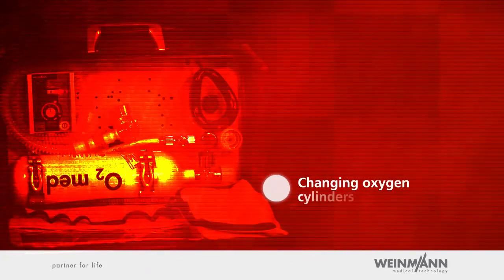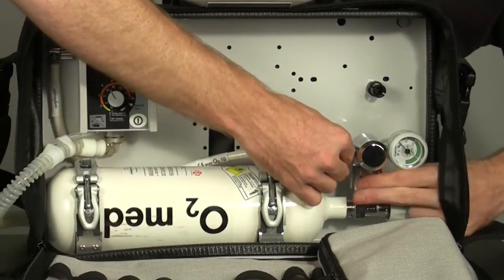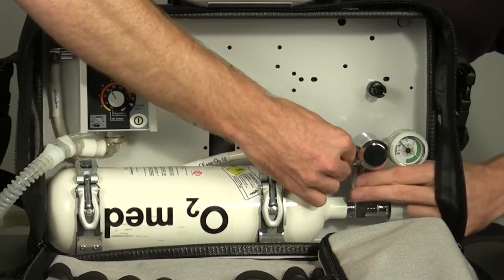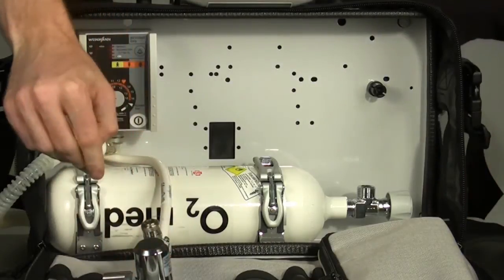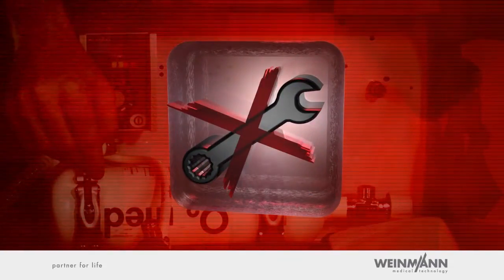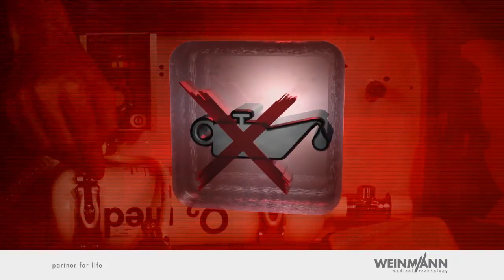Changing oxygen cylinders. To change cylinders, unscrew the pressure reducer from the oxygen cylinder. Before you loosen the screw, make sure that all the pressure has been released from the pressure hose system. You'll make the removal of the pressure reducer unnecessarily difficult if you don't release residual pressure in the line. Important: the tightening and loosening of all connections must be done only by hand. The device should always be kept free of oil and grease.